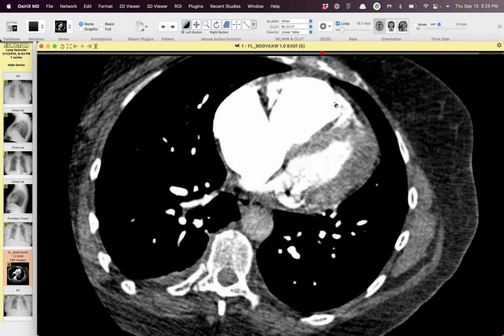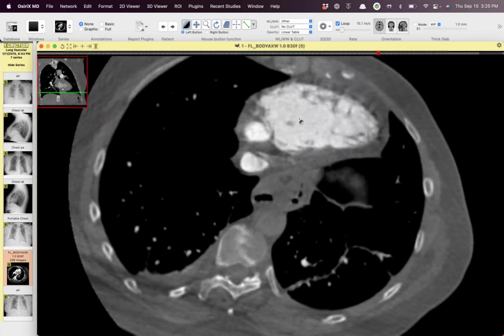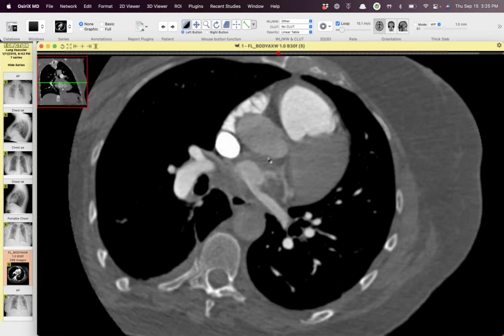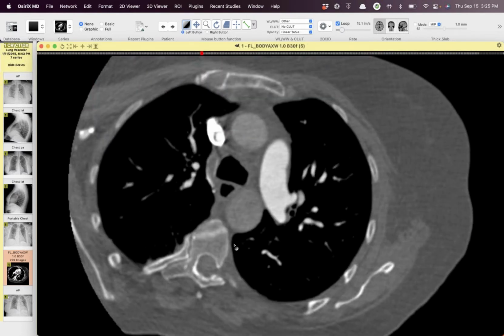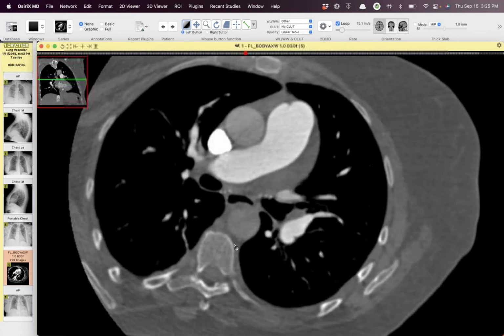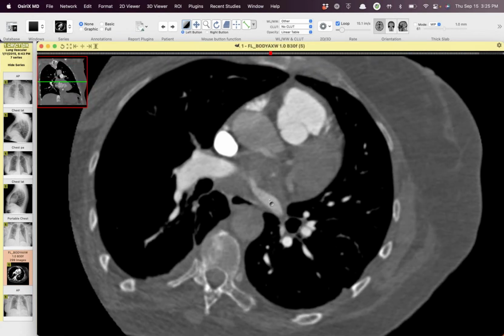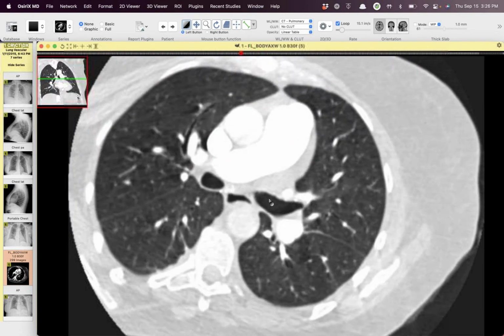I looked to see if the right coronary artery was knocked out. It's not. And she had the catheter in her at this time too, but that radiograph was from just before this. So Travis, it may depend on what sort of tablet she was injecting, what the excipient was. Yeah, the autopsy report said it was some cellulose and methyl cellulose. I don't know what the tablets were at that time.